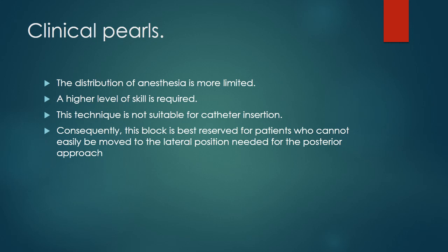In addition, this technique is not suitable for catheter insertion, because of the deep location and perpendicular angle of needle insertion required to reach the sciatic nerve. Consequently, this block is best reserved for patients who cannot easily be moved to the lateral position needed for the posterior approach.